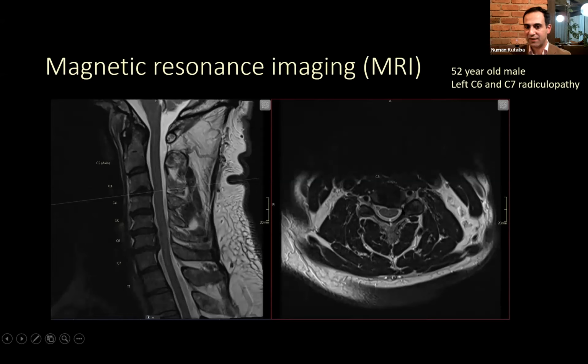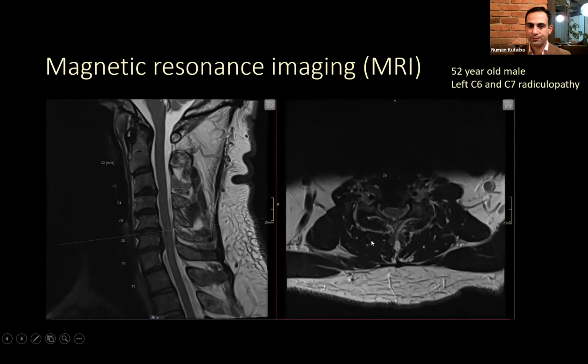This patient has left-sided disc changes at this level, but the patient is asymptomatic at this level. So it's very important to know that they're asymptomatic. We're not going to do anything about it. The referring clinician, whether it's a GP or a specialist, doesn't need to worry about this because they're asymptomatic from this.